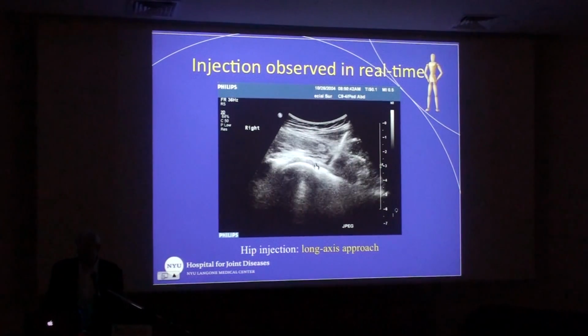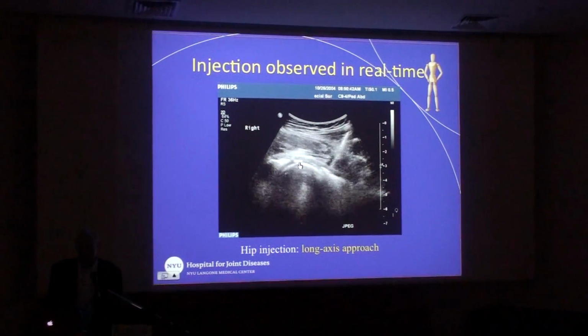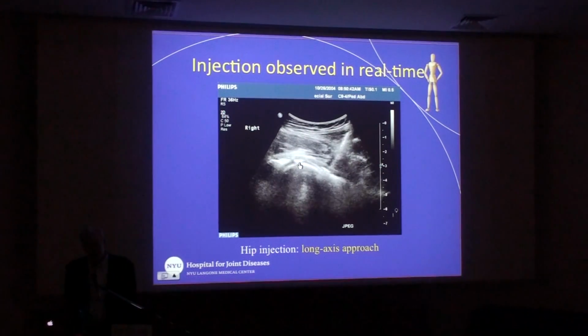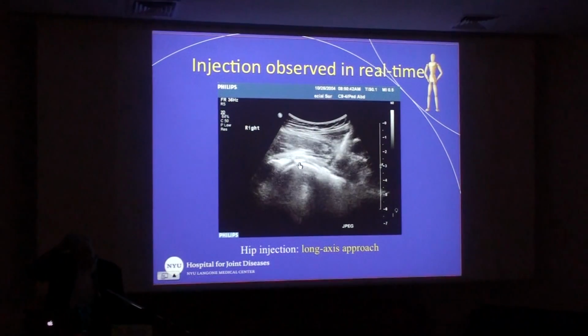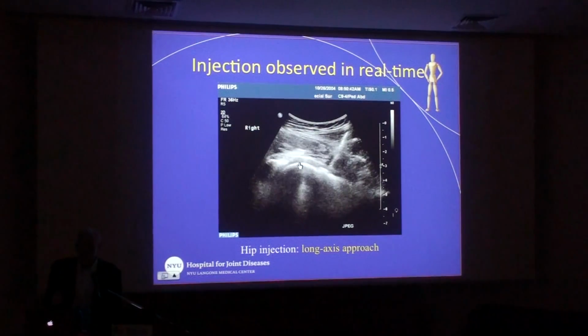When we're doing these injections, you see distension of the dorsal capsule of the joint. You see microbubbles filling the capsule, and so we know we're intra-articular. Now there are two types of contrast. There's contrast that we attain from microbubbles themselves, but usually because what we're injecting is a particulate steroid, something like Kenalog or Depomedrol, which is particulate in nature, it actually has its own intrinsic contrast.